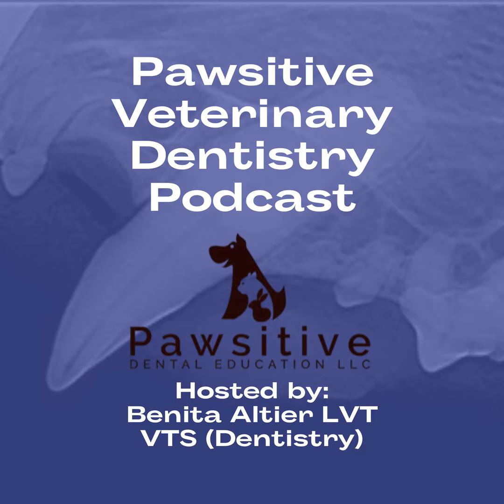I think it's easiest to see vertical bone loss associated with a canine tooth or the mandibular first molar tooth. Those are the times that I usually see the most vertical bone loss, but it can be associated with any tooth. So if it's very sharp, angular, and only associated with one side of a tooth root, that's going to be that vertical bone loss.